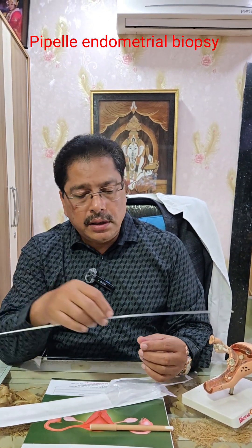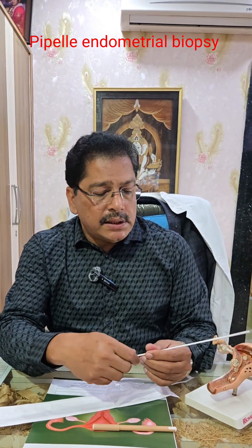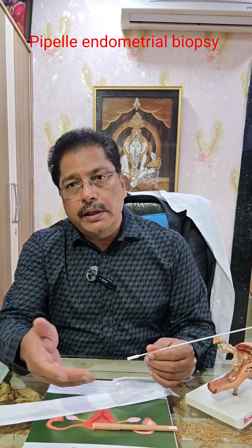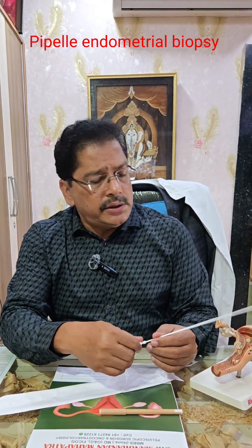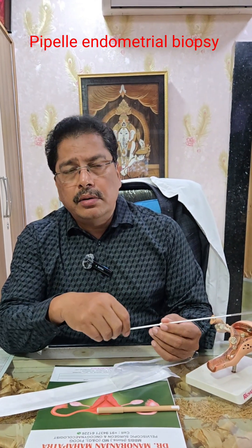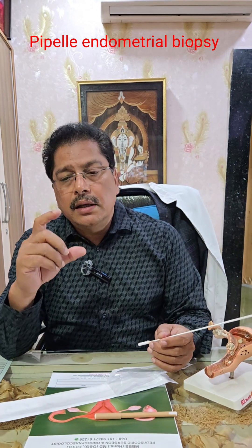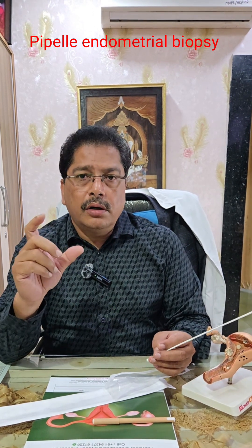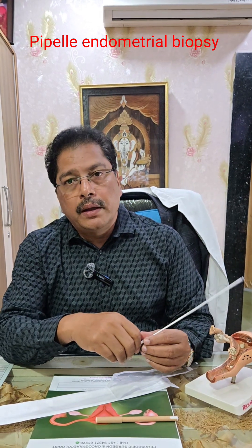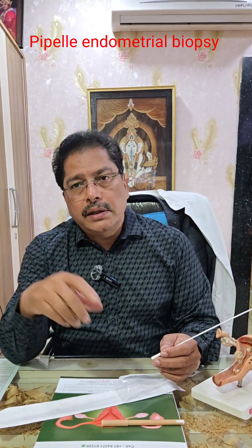The demerit is that while the patient is having active bleeding, we may not get the endometrium. In that case, ideally we should wait for the bleeding to stop. If the bleeding is not stopping or we are in urgency to evaluate, discard the first sample because it will be blood or clots. Then introduce again and take the sample. You can verify in the vial — clots will dissolve in saline, but the endometrium will not dissolve. That confirms the sample sent contains endometrium.